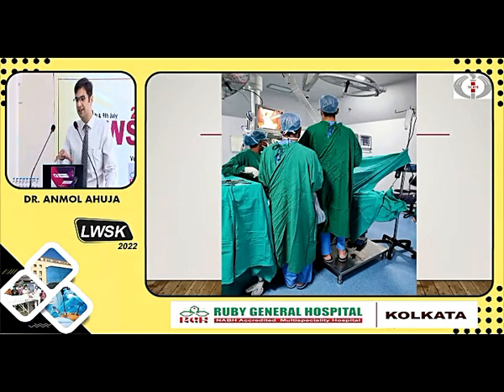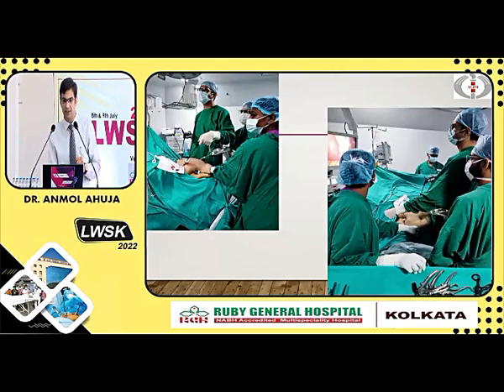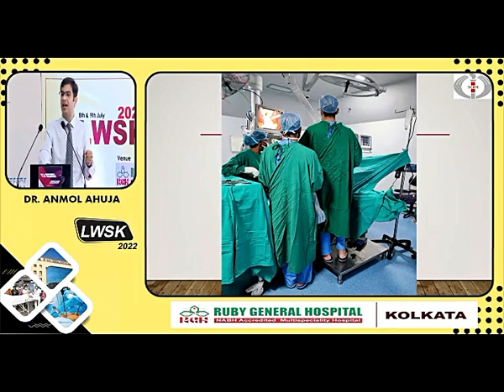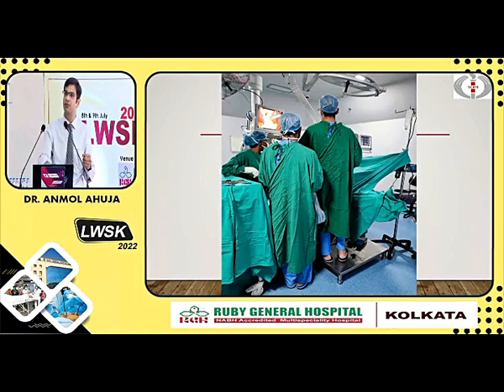So here you can see this is a simple case of lap chole. Don't mind this monitor, this is our secondary monitor here. So if you see, I am operating this case. For my height also, I am using a stool to stand on. Why? Because this table does not go very low and the patient was obese. So to get an adequate position for my arms, I use it. I know whenever I ask for a stool, everybody in the OR has the same question, why I am asking for a step to stand on. But never mind that. Always think that if I have to perform this surgery well, then our own comfort should be the topmost important thing.